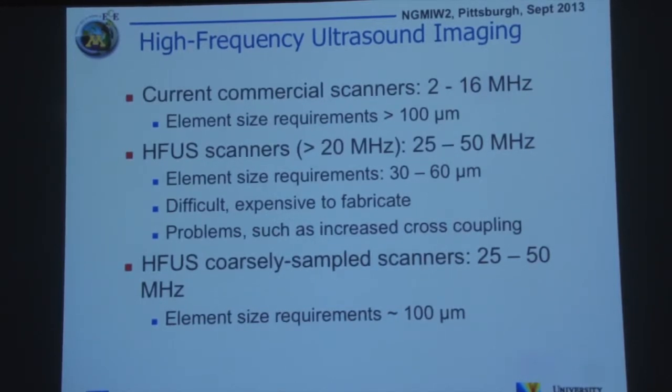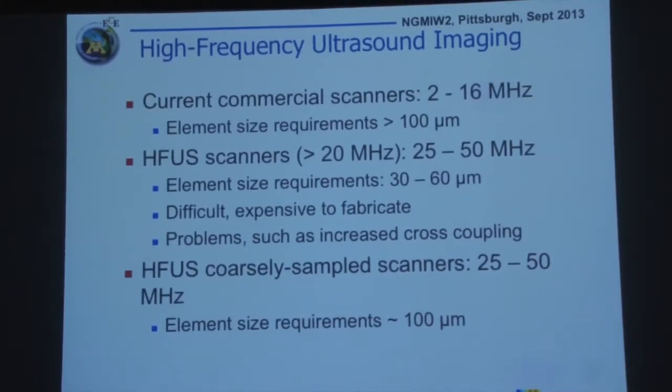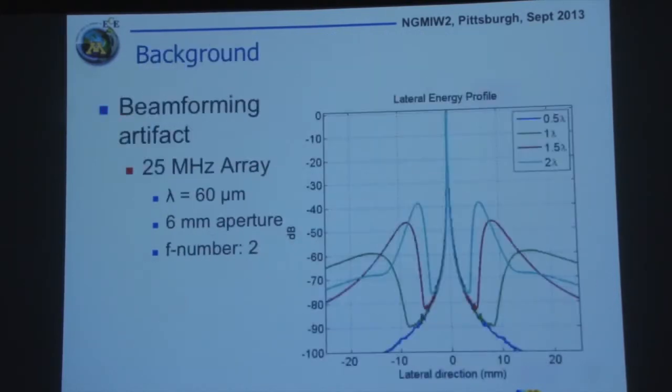This coding also requires some form of reconstruction, some form of inverse filtering. So we have also taken an approach. We wanted to do a tomography problem, but we also wanted to live with existing imaging systems. So for example, what I'm going to give you is an example of linear array imaging with ultrasound, where we're able to use this reconstructive technique to compensate for the kind of thing that happens when you increase the size of your elements for sampling your aperture.